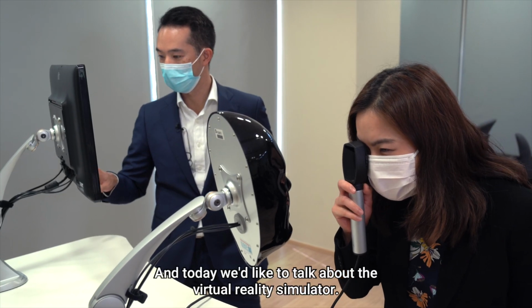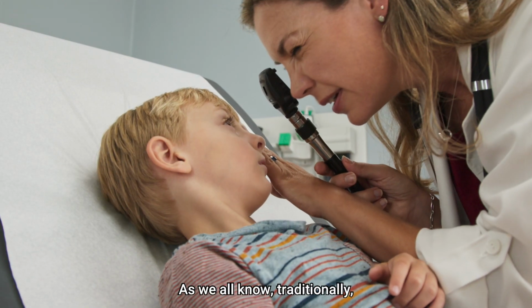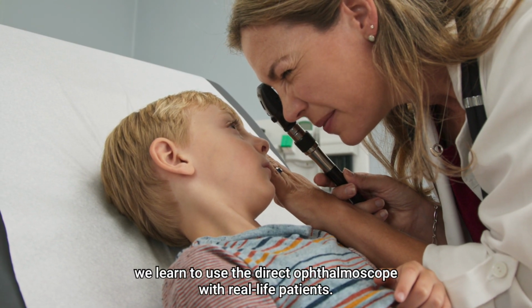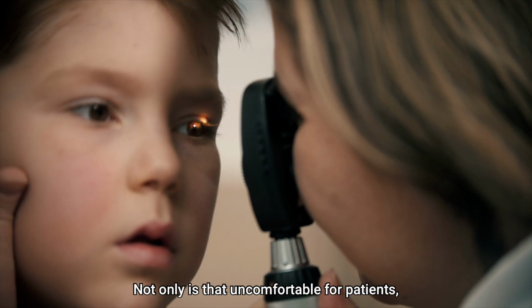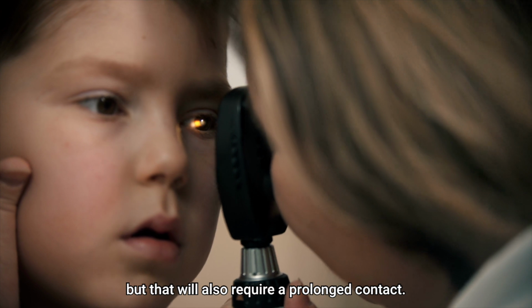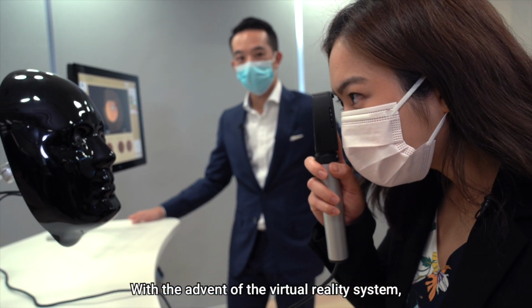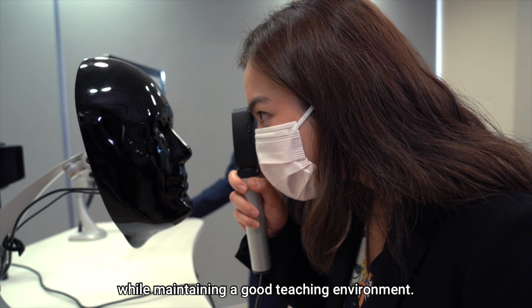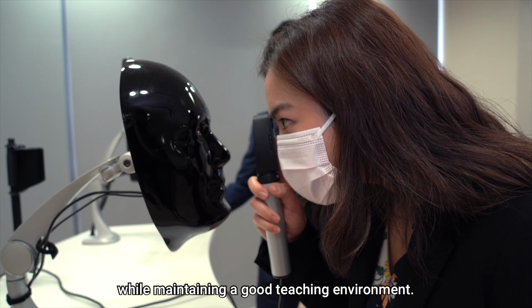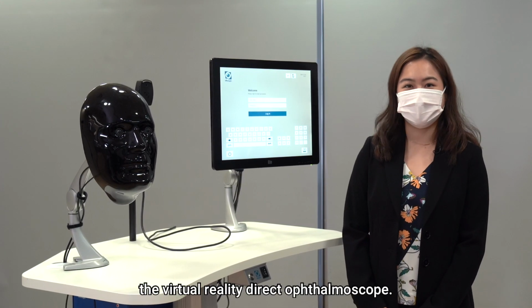And today we'd like to talk about the virtual reality simulator. As we all know, traditionally, we learn to use the direct ophthalmoscope with real-life patients. Not only is that uncomfortable for patients, but they also require a prolonged contact. With the advent of the virtual reality system, we hope to reduce discomfort to patients while maintaining a good teaching environment. There are many benefits of using the virtual reality direct ophthalmoscope.